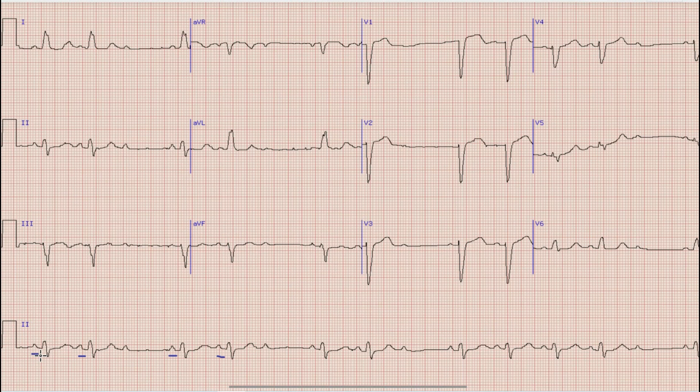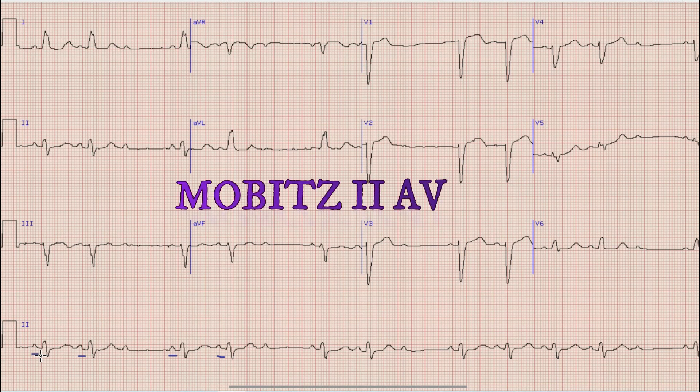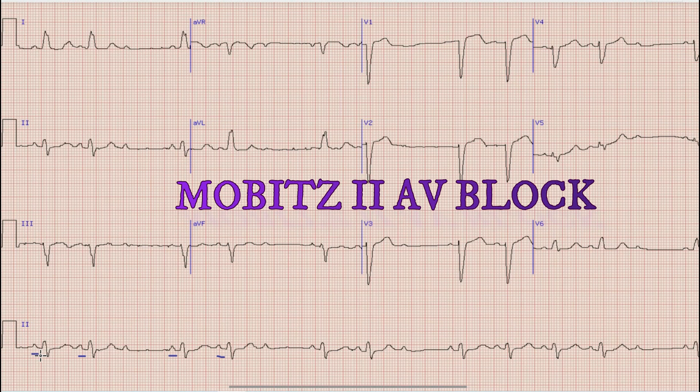In case of a constant PR interval, the second possibility would be a Mobitz Type 2 AV block. As we know, in Mobitz Type 2 AV block the PR interval is fixed while the RR interval is variable. We have already established that the RR interval in this case is variable, and with the PR interval being constant, this is a Mobitz Type 2 AV block.